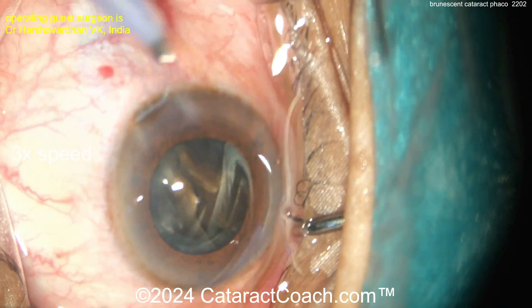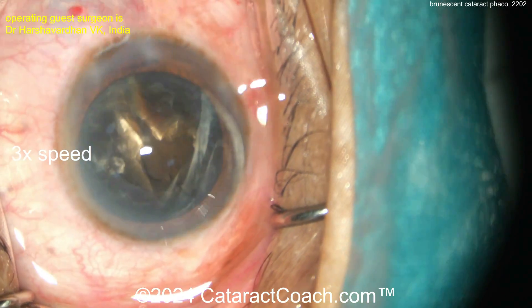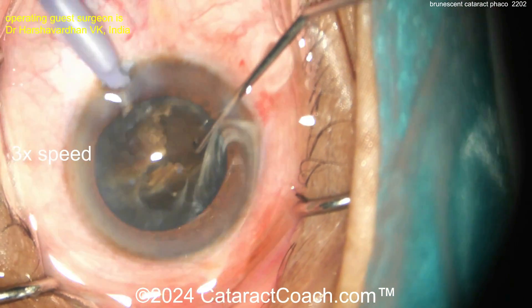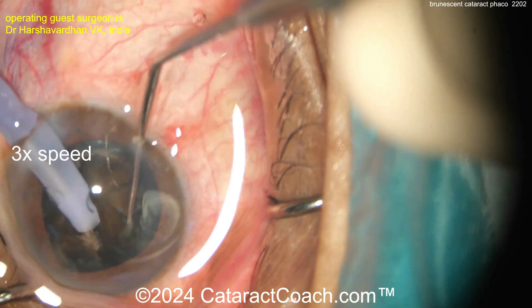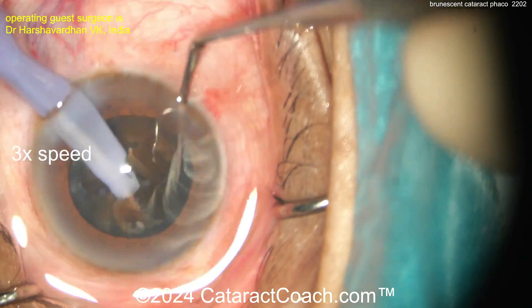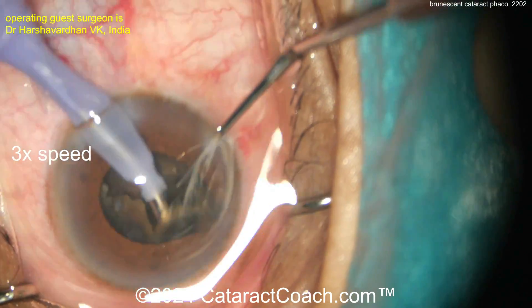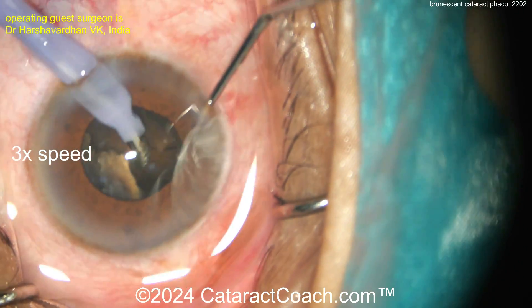You really have to put your effort in to get those pieces separated — chop, chop, and more chop, plus more viscoelastic. This surgeon appears to be using HPMC — hydroxypropyl methylcellulose — sold in the USA as OcuCoat from B&L. That's a viscoelastic that washes out of the eye pretty easily, so in the US I'd prefer a different viscoelastic, but I commend the surgeon for the beautiful job here.